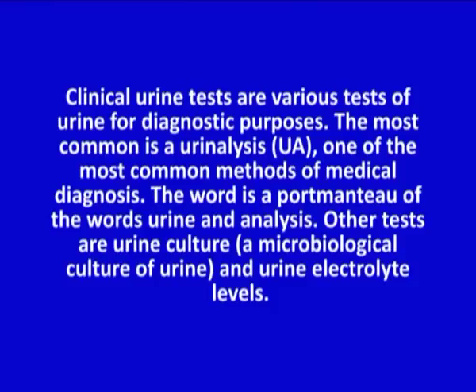Clinical urine tests are various tests of urine for diagnostic purposes. The most common is a urinalysis, one of the most common methods of medical diagnosis. The word is a portmanteau of the words urine and analysis. Other tests are urine culture, a microbiological culture of urine, and urine electrolyte levels.